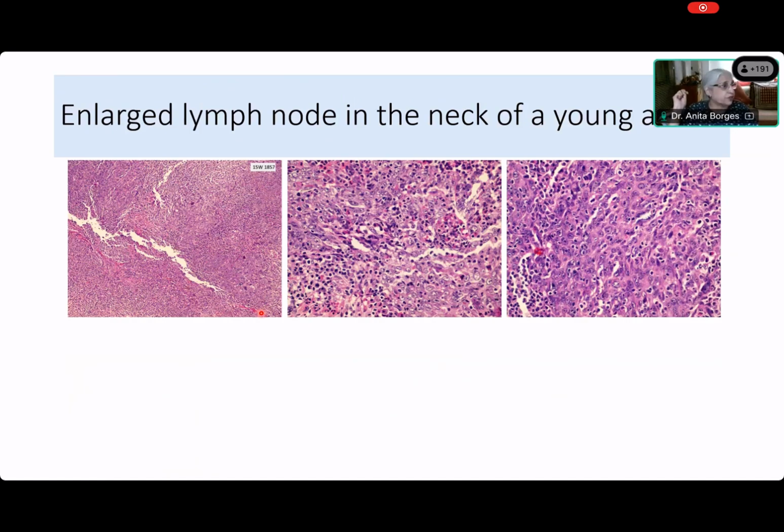So what differentiation do you see? You understand what we mean when we use the term poorly differentiated on H&E morphology? Yes, what do we mean? Tumor with poor morphological differentiation. That means we can't see glands, keratin, pigment, anything that will tell you what this tumor is. Yes, Deepak? Have you gone offline or what? Can you hear us? Okay, we can't hear you. All right, Deepak seems to have disappeared.